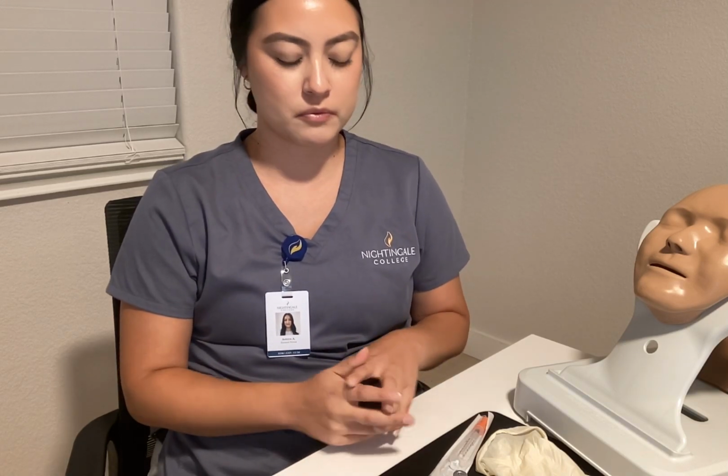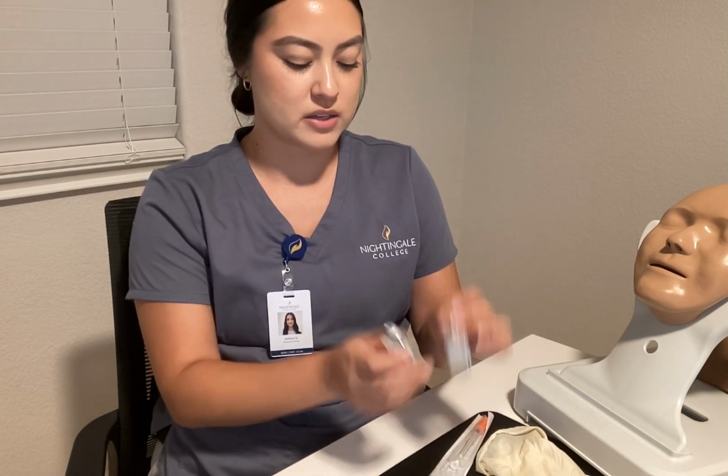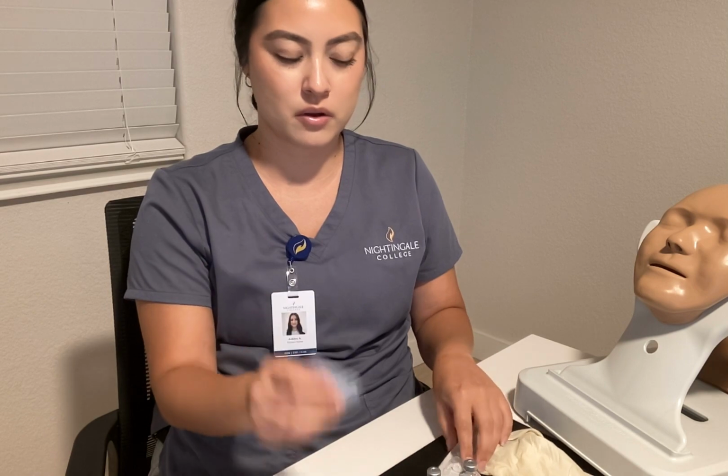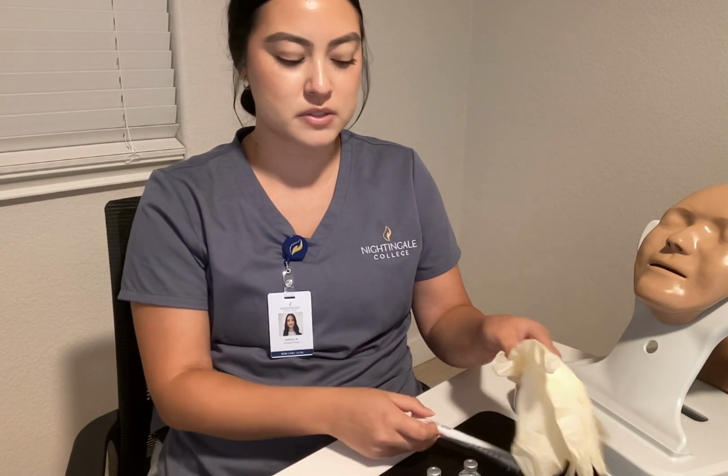Today we're going to be drawing up insulin. Before we get started, we have our two insulin vials, regular and fast acting. We have our alcohol pads. We have our insulin syringe and needle and our gloves.